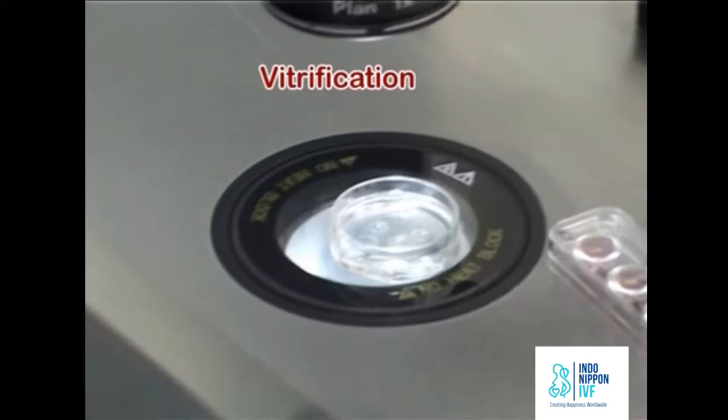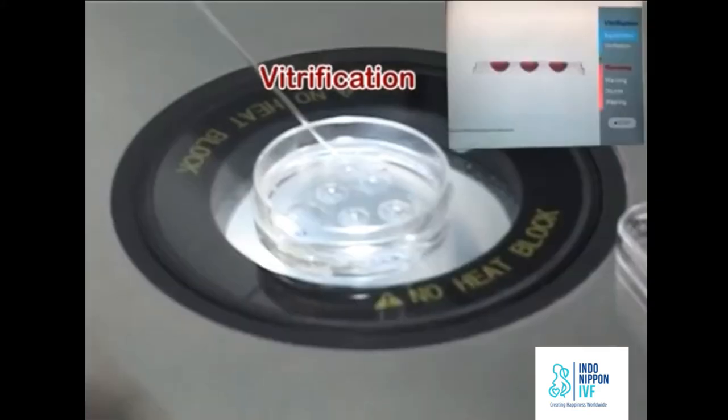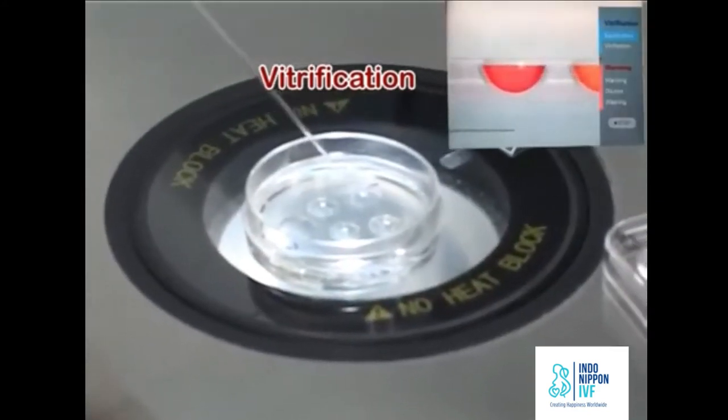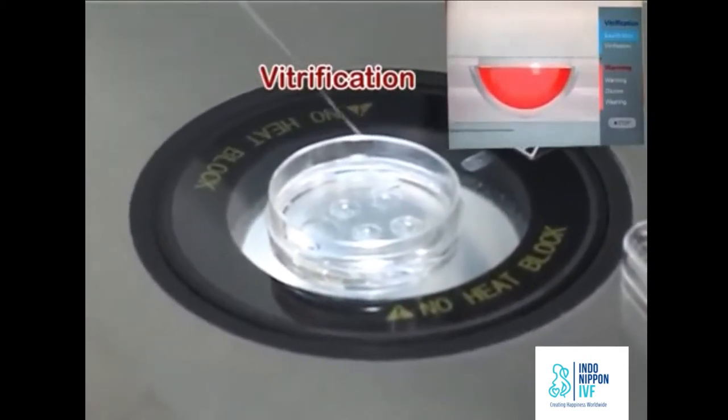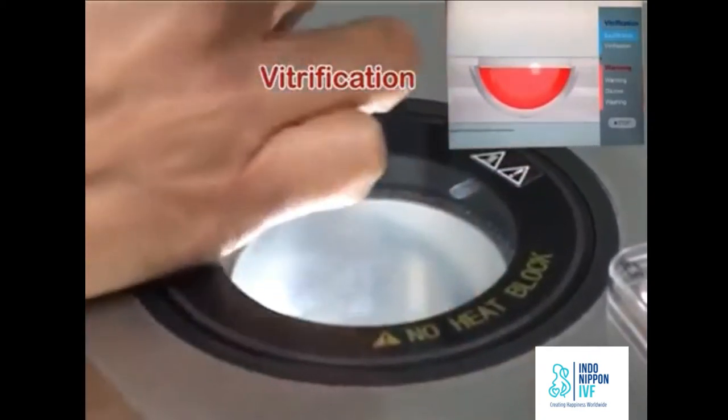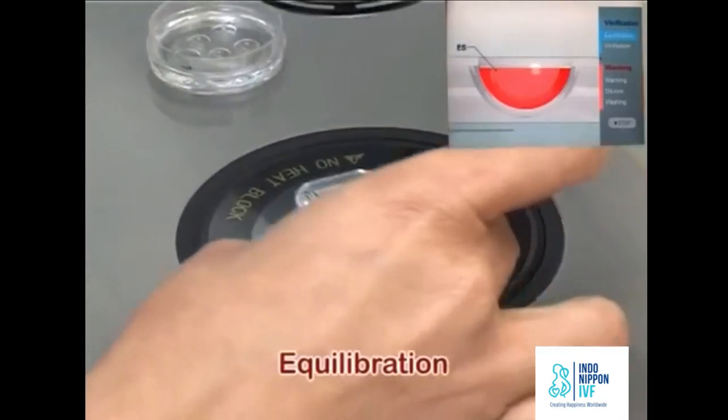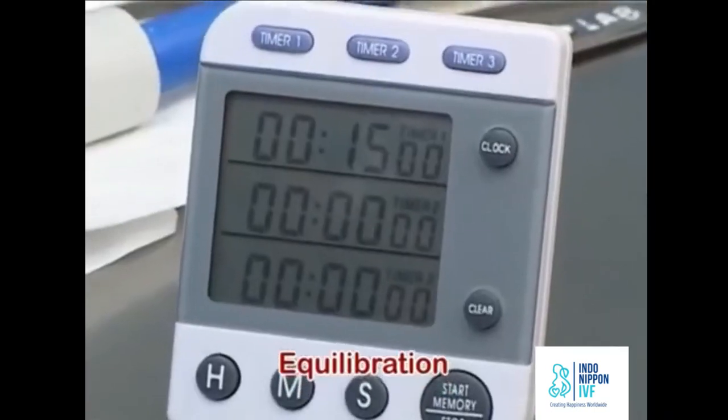Check the quality of the oocyte under the microscope. Note the width of the perivitelline space. For oocyte vitrification, the cumulus cells must be removed. Aspirate the oocyte at the tip of the pipette. Transfer the oocyte with minimal amount of medium on the surface of ES well and start the stopwatch.